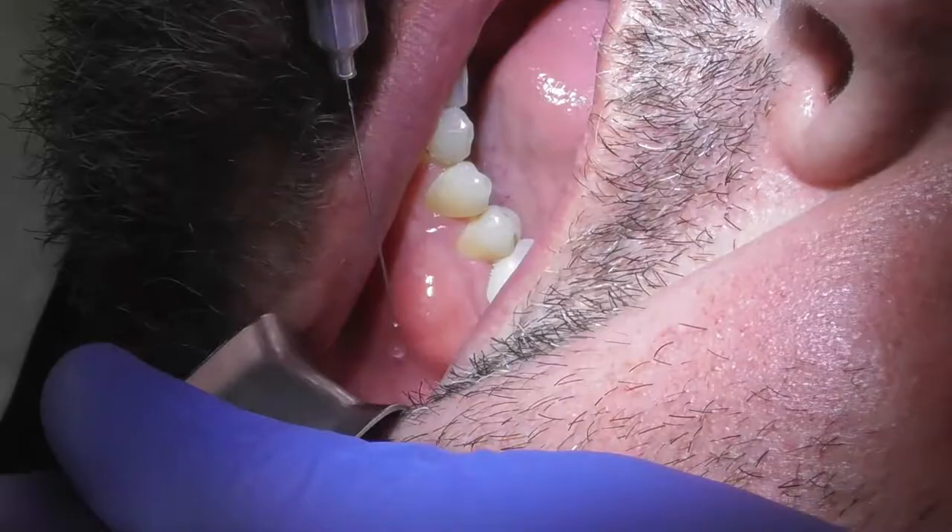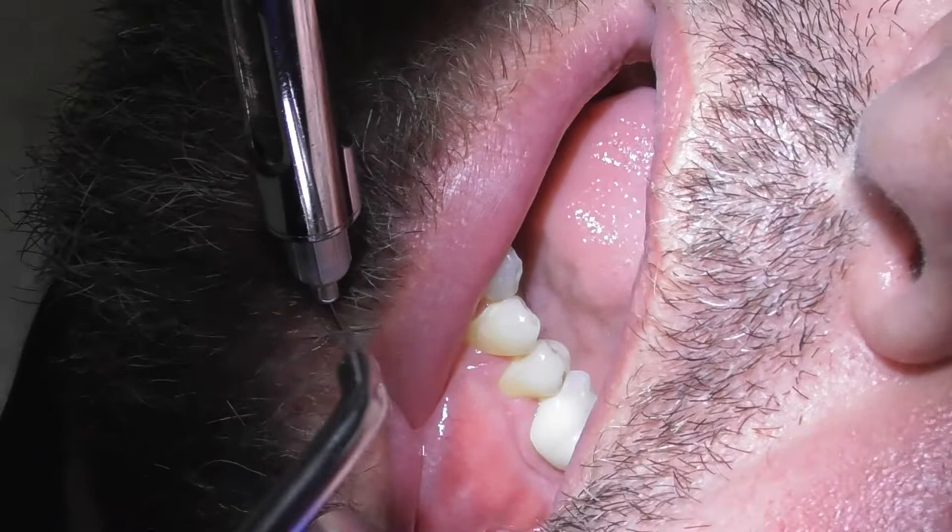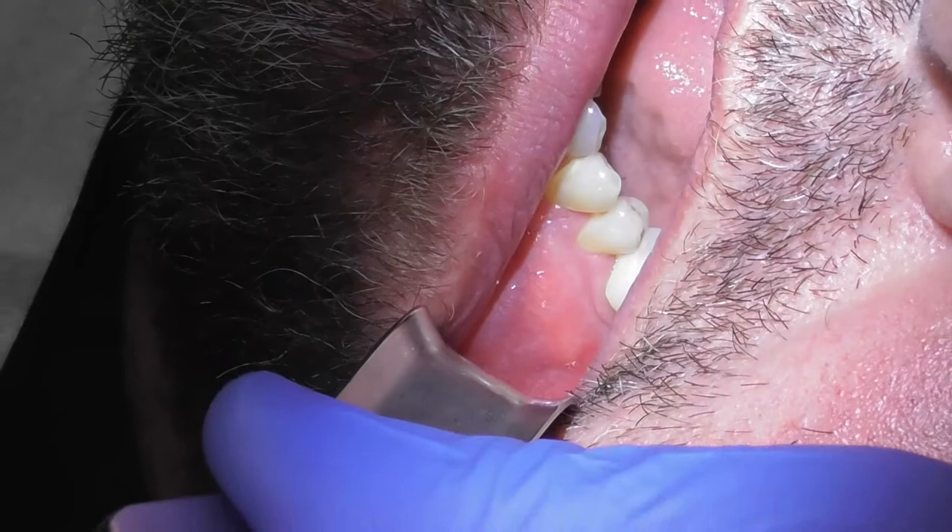I'm going to top you up with a little more local — you should not feel this. I'm just going to give you some more numbing. You can feel that? Okay, so we definitely needed to add a little bit more local anesthetic. Should be lightening up — is that lightening up?